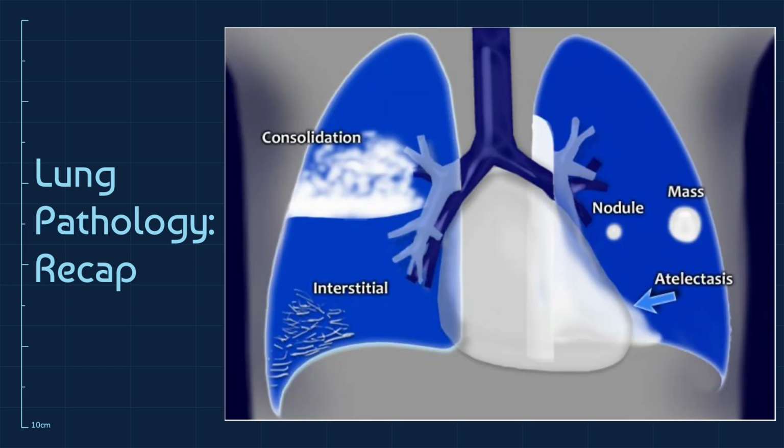And in this infographic, we can see how the pathology is labeled differently and represented on a chest x-ray differently depending on which anatomical structure it's affecting. For example, the consolidation, which is basically any pathological process that fills up the alveoli with either fluid, pus, blood, cells such as tumor cells, or any other substances, may result in diffuse, lobar, multifocal, or ill-defined opacities in certain areas, in certain lobes.